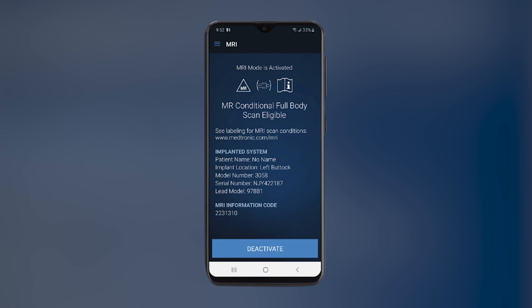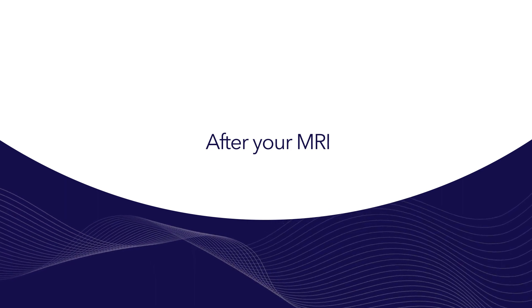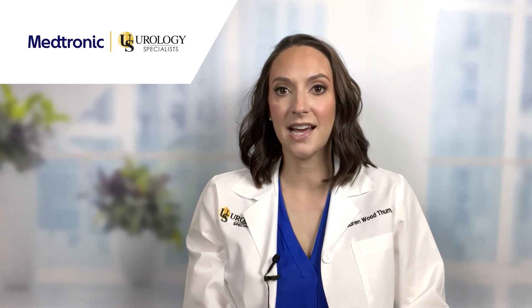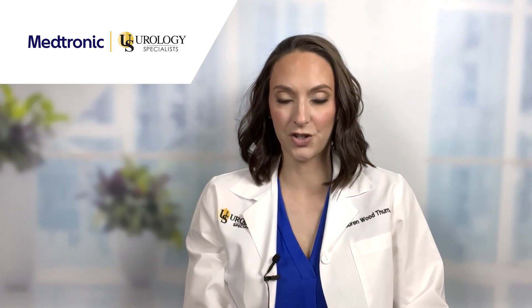This will also reveal your MRI eligibility. When your MRI scan is complete, follow the same steps as above and select Deactivate, then Yes when prompted with the question, 'Do you want to turn therapy on?' to return your device to your initial settings.